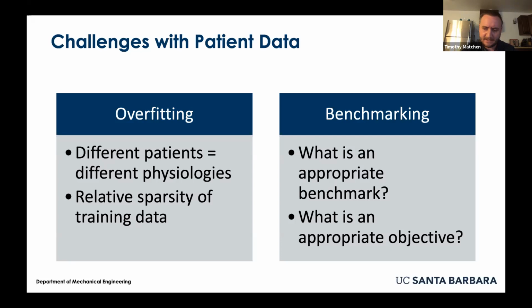As I mentioned before, one thing we see with deep brain stimulation is that there's this elevation in the beta band. And in a very coarse sort of way, we can say that what we're interested in is eliminating bursting in this beta activity, or in this beta frequency range.